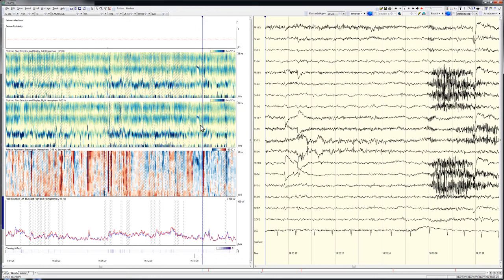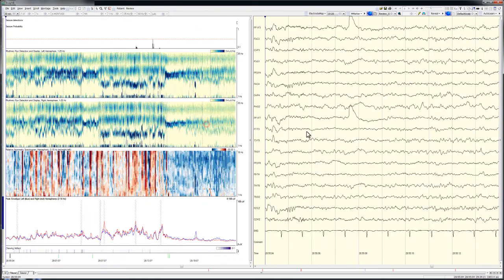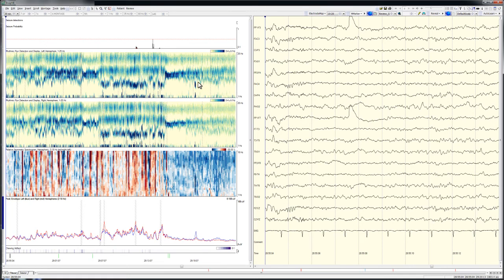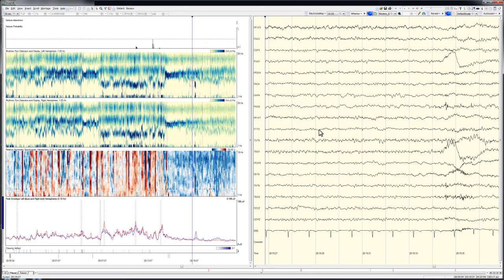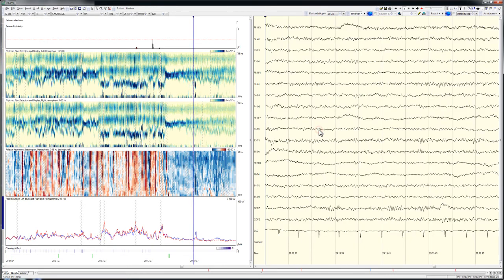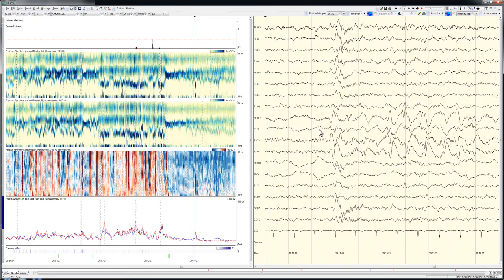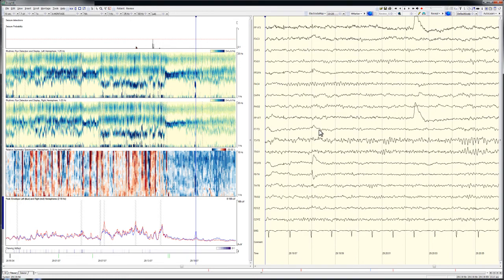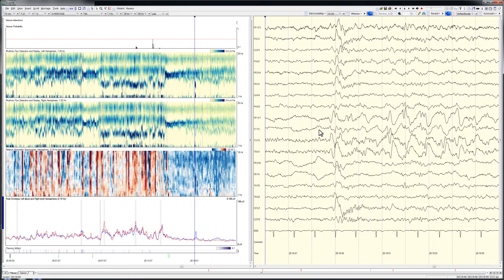Several prominent asymmetric increases in left hemispheric rhythmic activity are also found, and these correspond to runs of left temporal sharply contoured rhythmic delta activity with intermixed faster patterns that persist for 8 to 12 seconds before abating.